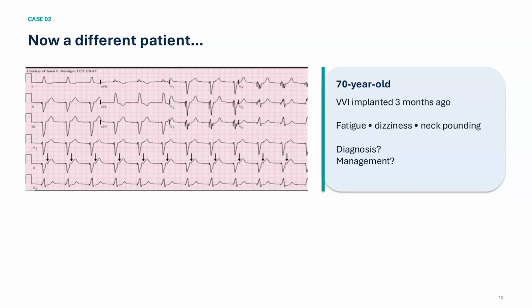You understand? So keep it, but you should adjust the rate response parameter of the R. If the patient has AF with intrinsic rhythm more than 60, and the pacemaker is in VVI mode with the lower rate limit adjusted to 60, the pacemaker will not pace. It will do intrinsic and intermittent pacing, as AF is irregular.